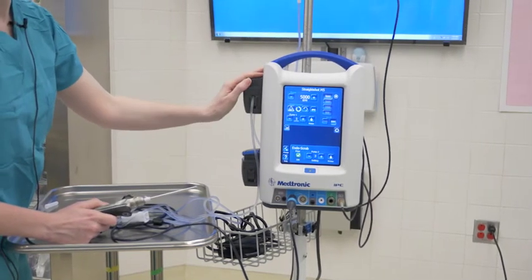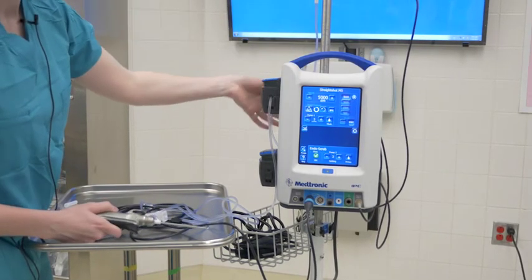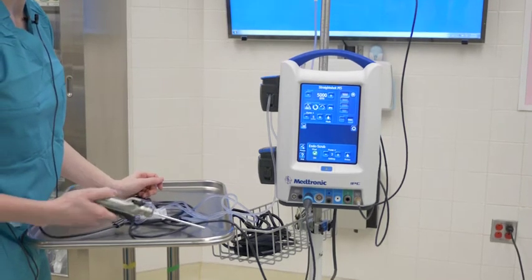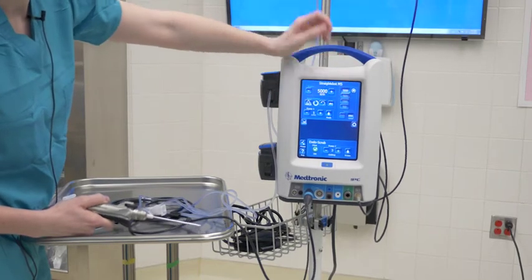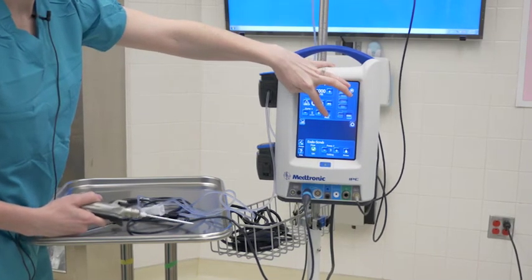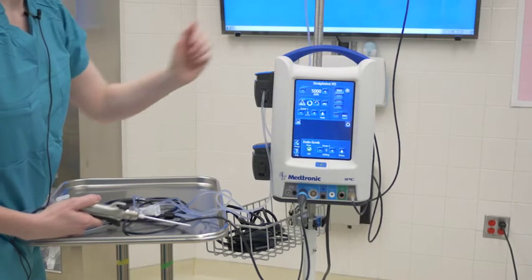So it will definitely prime. So hit prime, and it will auto flush. And I already have water at the end, but it will stop on its own. Or you can say stop by hitting flush. If the water or saline doesn't go all the way to the end, you just keep holding the flush until you're primed. Okay?